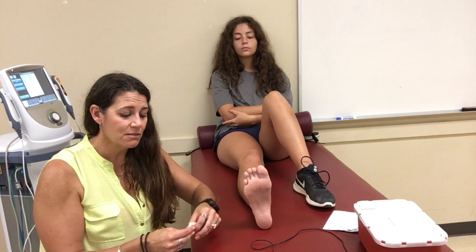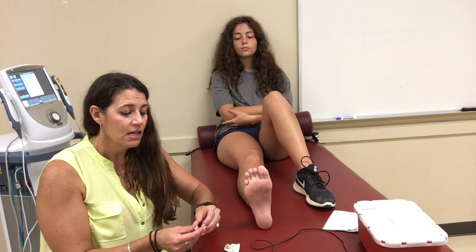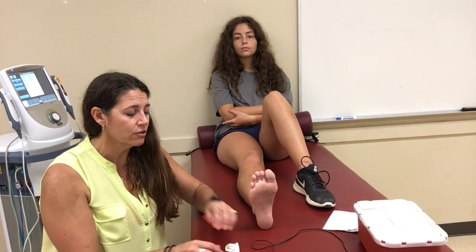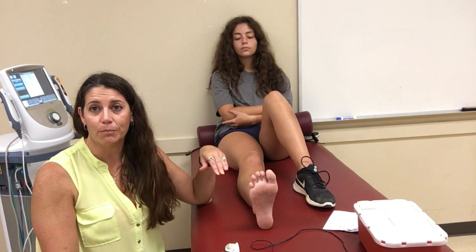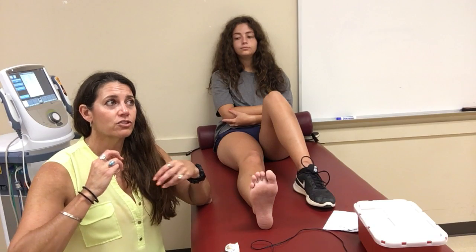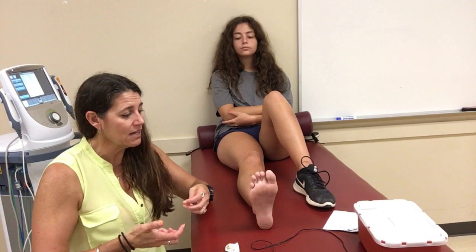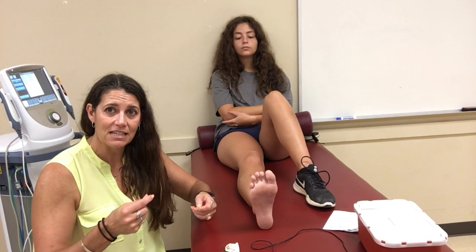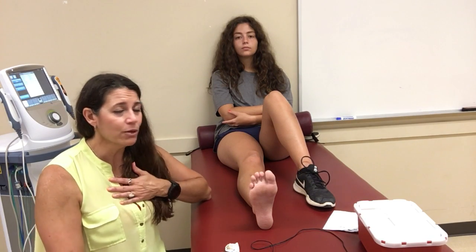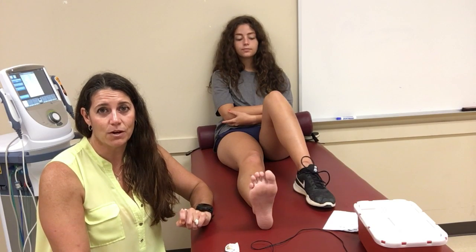After the treatment, as you remove the pads, inspect the skin carefully. Because you're driving direct electrical current with medication into the tissue, you may see small burn marks and redness. Document that, and ask the patient to monitor the area. Also stay with or regularly check on the patient during treatment — even without changing the intensity, some patients become hypersensitive over time and you'll need to turn the intensity down to prevent burns.